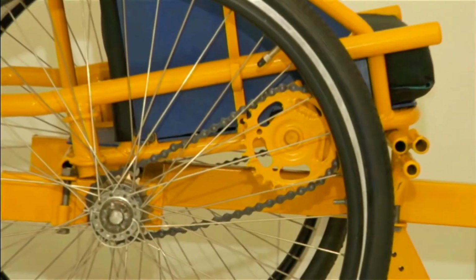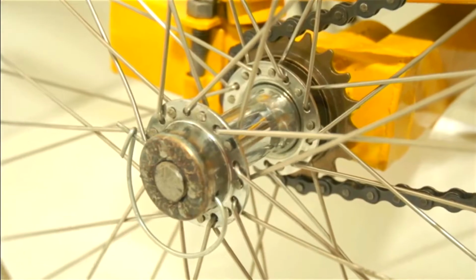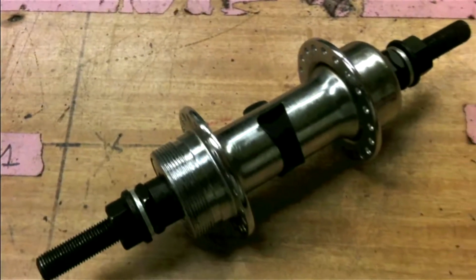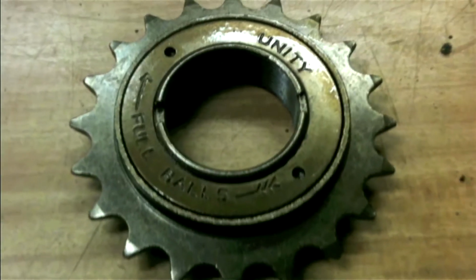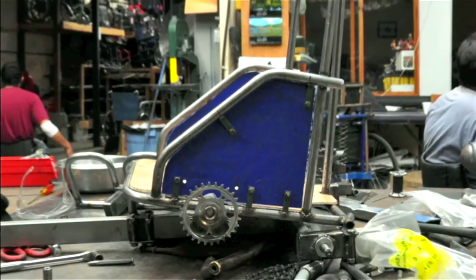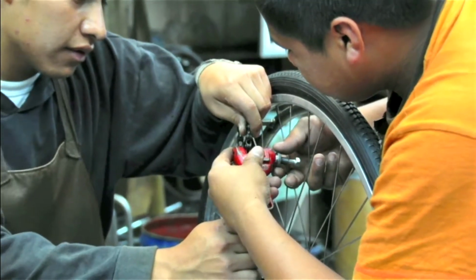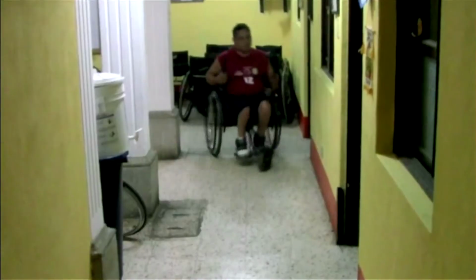Every single moving part on this device is actually made from bicycle parts. And we looked around the world to find the most commonly available bike parts that you could even source in a village in India or Africa, so you could make and repair the chair in these rather resource-constrained settings.